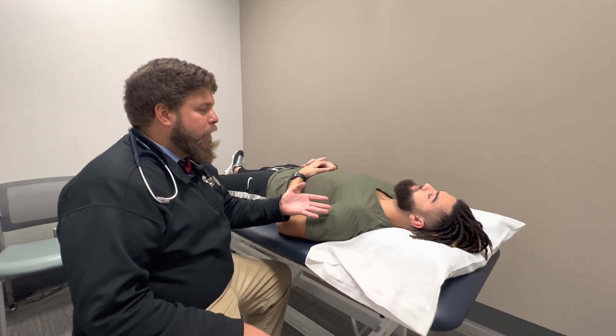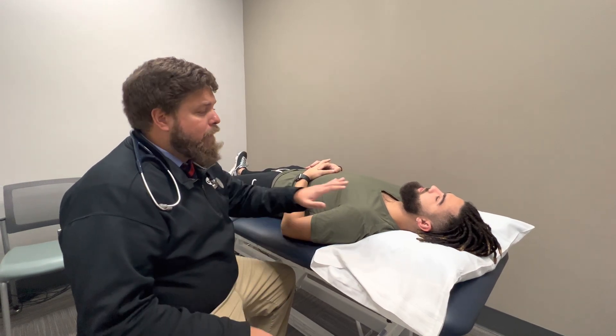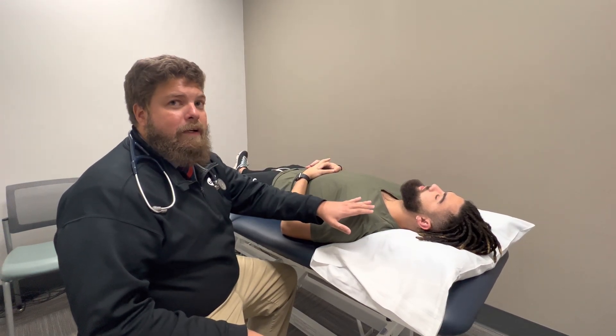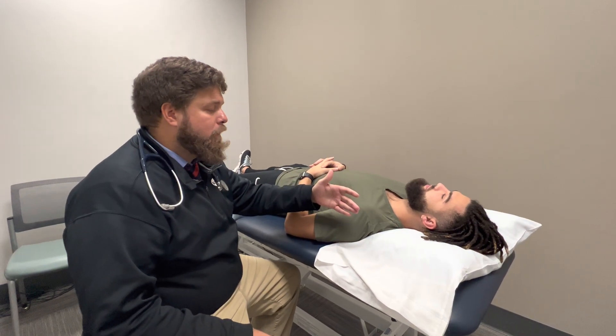Josh here is going to be serving as our volunteer, and we'll be going over palpation and auscultation. We're only going to demonstrate on his left side, but he'll do the same thing on both sides. You'll always check bilaterally for auscultation of the carotids.